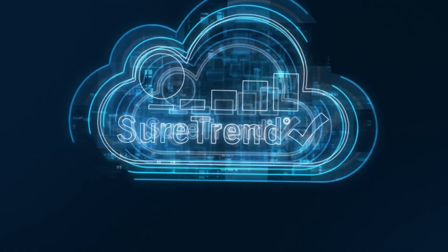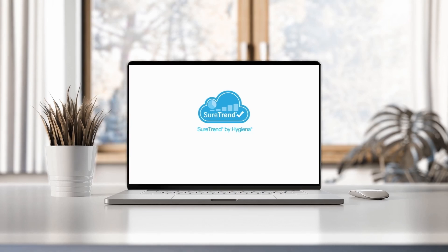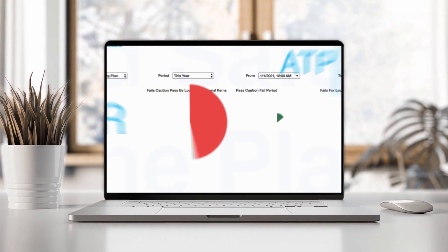CFU results are displayed automatically in 10 seconds. Results are synchronized in real time with SureTrend Analytics software. Gain the full picture of your food safety data in a single platform.